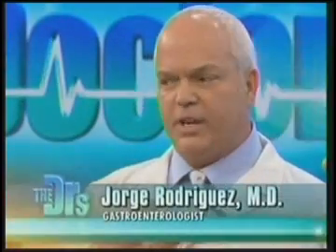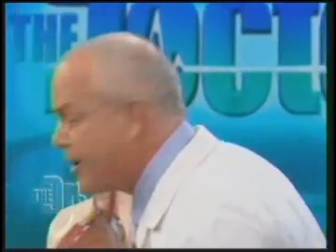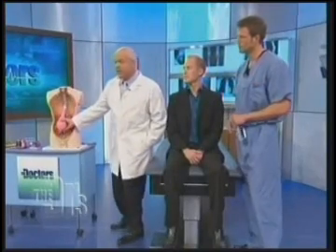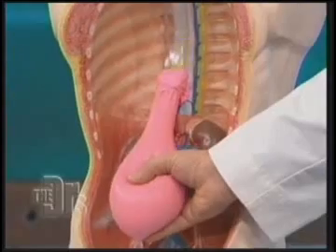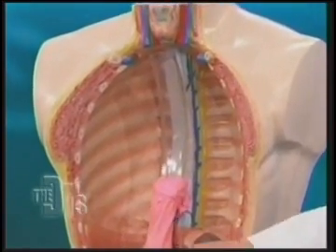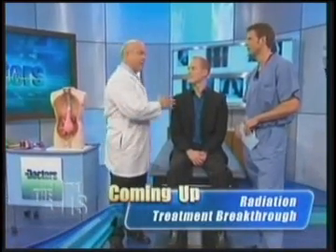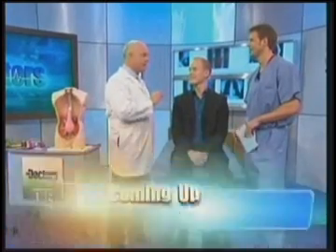And pH is a measure of the acidity for people who don't know that at home. Exactly. The stomach makes acid, and the pH of the esophagus should be only around 6. So when acid abnormally comes up to the esophagus, it's not supposed to be there, so it obviously burns the esophagus. Here we have our little reproduction of a stomach, and the stomach has contents. Some people, here we go, have a little bit of reflux. Some people have it all the way up. The problem is that it can come so far up that it can burn your throat. For some people, it can go into your lungs. It can cause asthma, coughing, and poor Jacob, I mean, he had it all the time, really all the time.